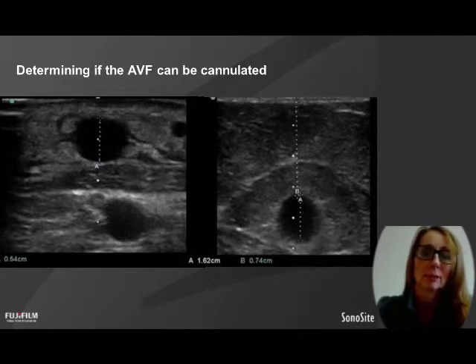Or even if it's not too deep, it's very good to have the ultrasound to guide the cannulation, because if you're off track just the littlest bits, I'll show you with my arrow, if I start at a slightly crooked angle and I insert into this vessel just on a slight angle, I'll still puncture fine. But if I start inserting here on a slightly bad angle, that angle with the fulcrum becomes wider and wider the deeper I go, and all of a sudden I've just cut a hole in the side of the vessel.